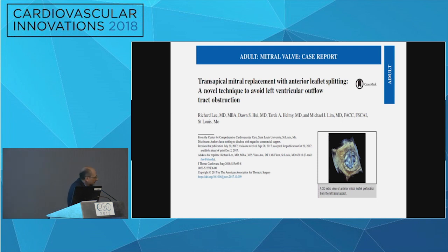It's a great case, and a bunch of us, under the leadership of Guerrera, published the one-year outcome of the valve-in-MAC registry. What was interesting was that up until this point, there are more commercially available valves put in the mitral position than all the dedicated transcatheter mitral valves combined.